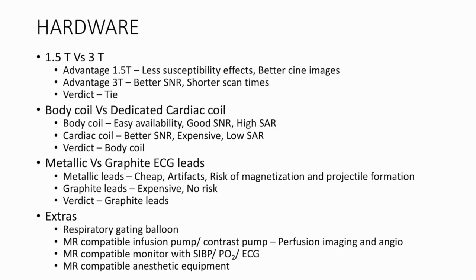effective cost. Metallic leads are cheap but produce a lot of artifacts, and there is a real risk of magnetization and projectile formation. Graphite leads, though expensive, don't have the other negatives and are preferred.